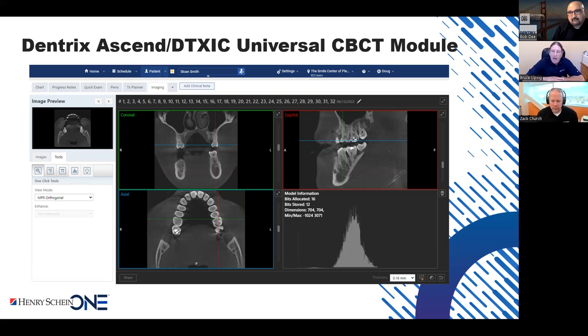Zach, have you heard good feedback from the team as far as the three-dimensional imaging? Yeah, I have.